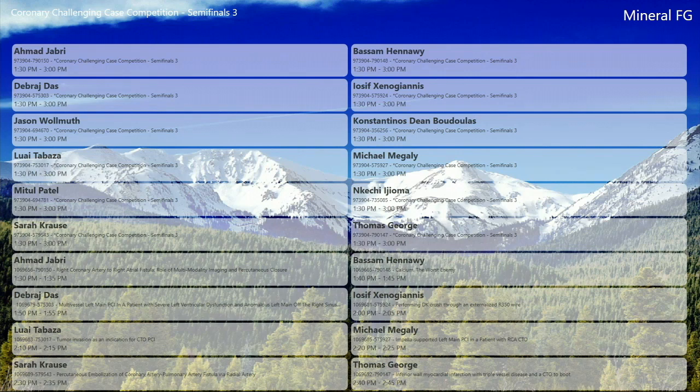The other thing is if you can get flow in that vessel, get TIMI-3 flow back even with a residual lesion, this guy could be a candidate for bypass still, especially if you haven't loaded him. If you're using IV 2B3As or Cangrelor or something like that to get you through the case, and you get flow back in the vessel, park him upstairs or wherever your unit is, get a surgeon involved, and they'll operate on him in 5 days.